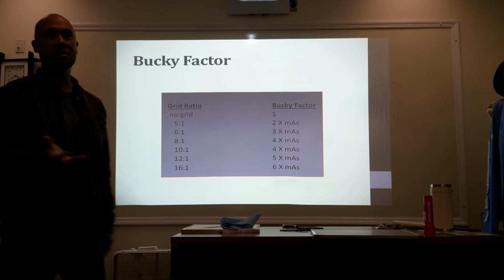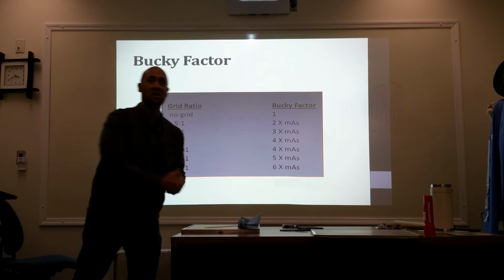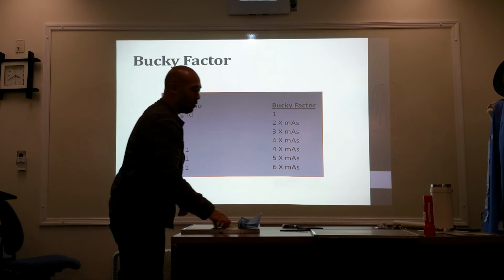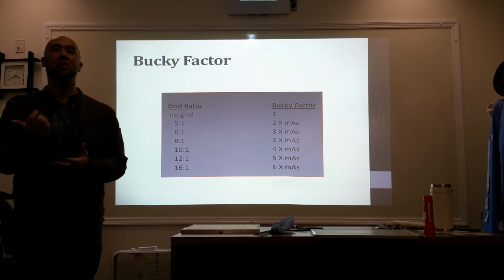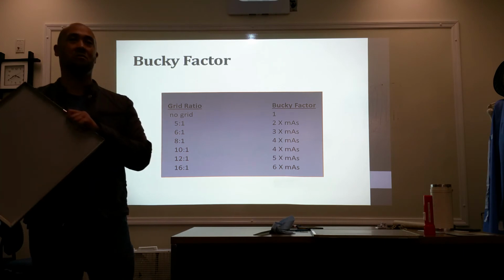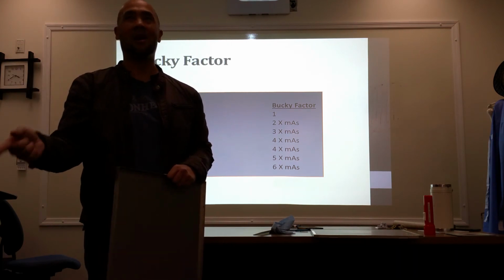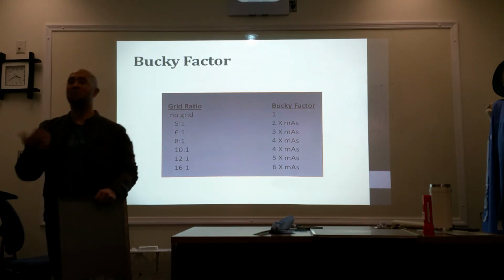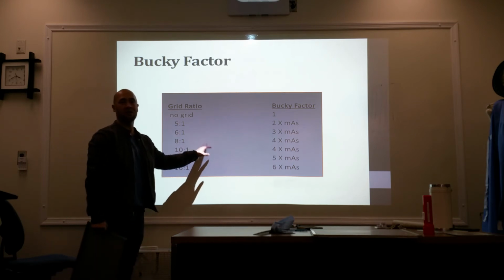What the heck are you talking about, Dr. F? Well, let's just say, for example, I'm going to the emergency room. In my department, I have a set of technical factors that I know will work each and every time without a grid. But now I'm going to be bringing my grid along with me to the emergency room or the operating room. Knowing what I know about my original technique that works in the department, I'm out of my department now. So what type of modification do I need to make with my technical factors to give me the proper density on my film? This is where the Bucky factor comes in.